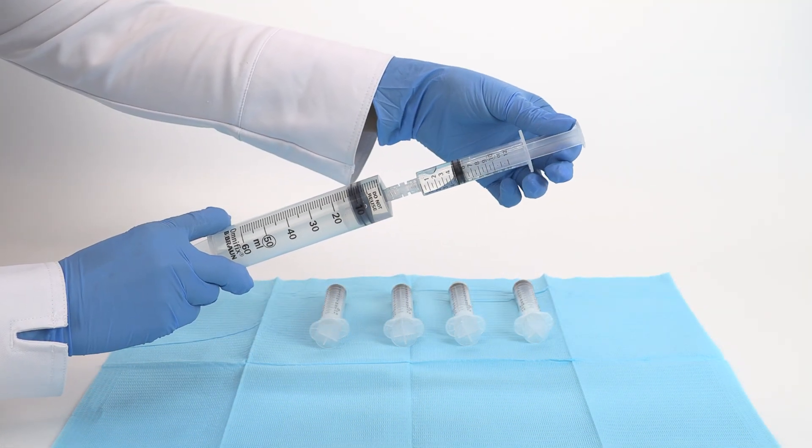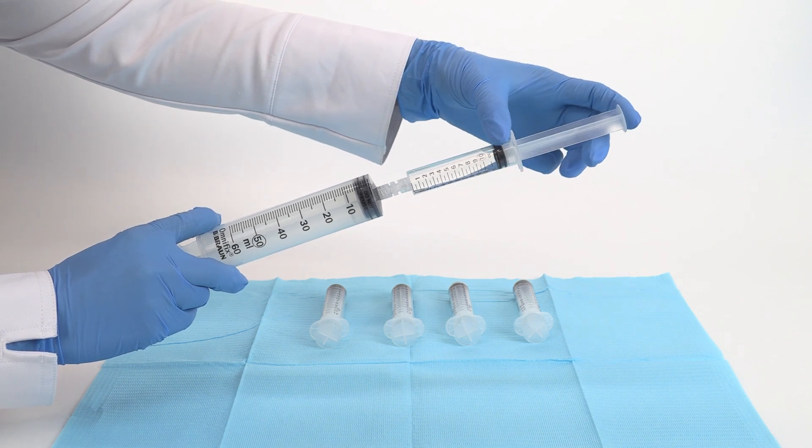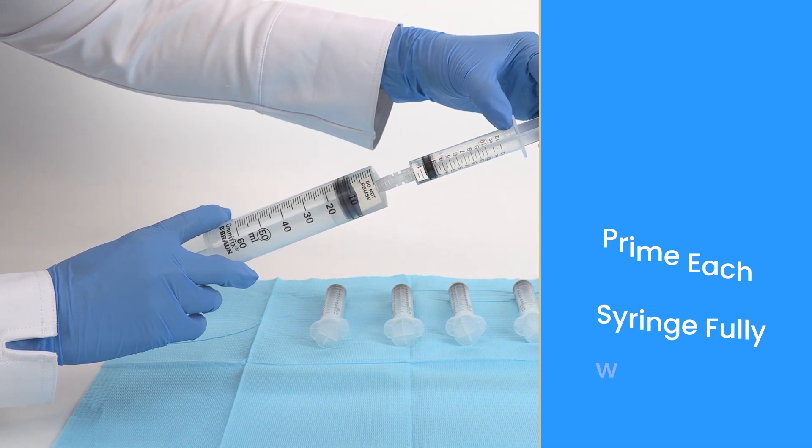Transfer the heparin to 5 twelve-milliliter syringes, putting 1 milliliter of heparin in each syringe.